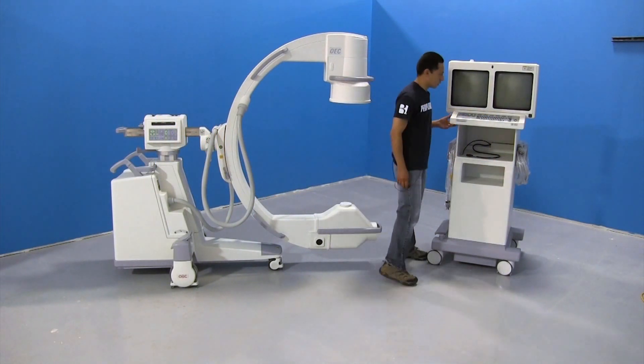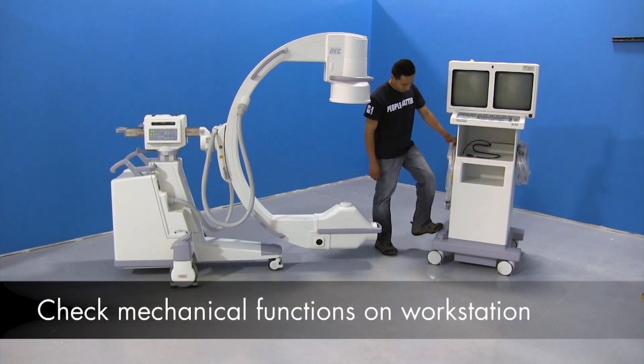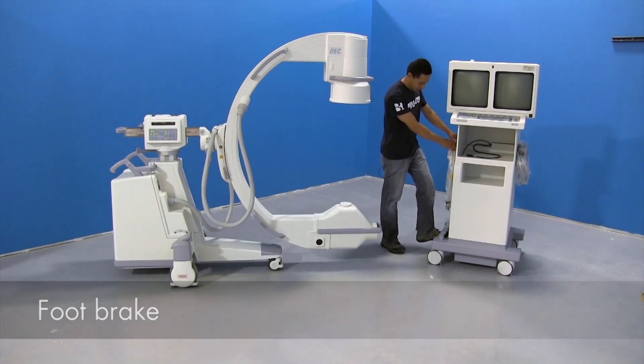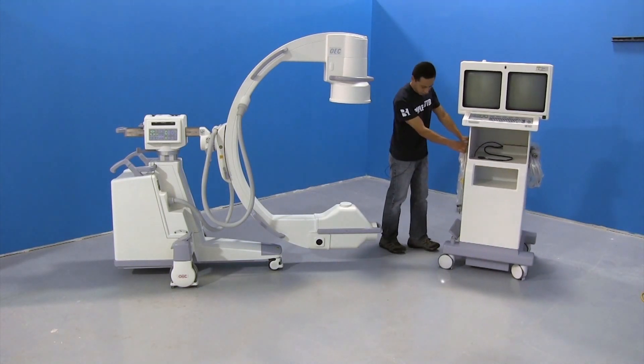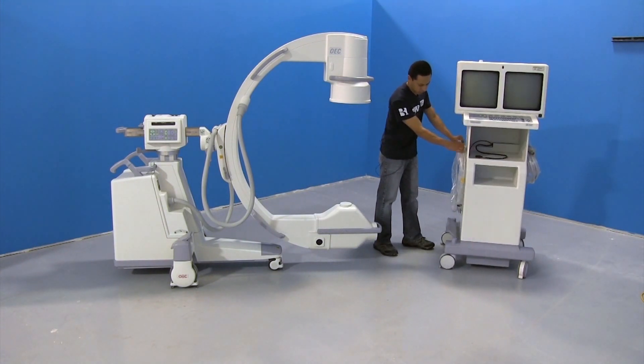We're going to start with the workstation here and check the mechanical functions. You have the foot brake right here — press it down, make sure it doesn't roll away. In the center you should be able to move it around anywhere. And when you bring it up, the back wheels should lock, leaving only the front wheels able to steer it.